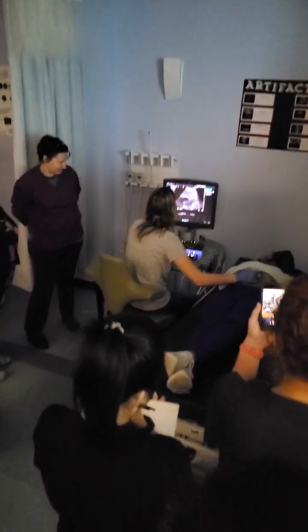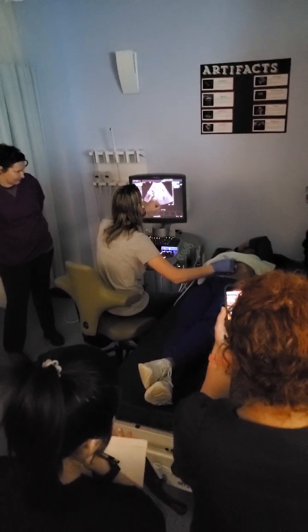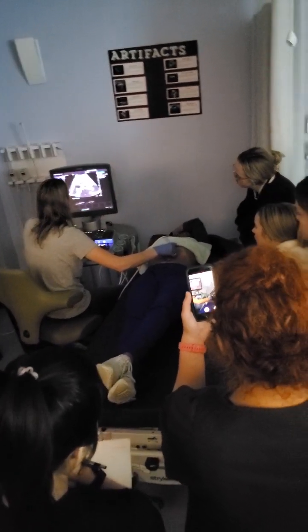So here we are in the left lobe of the liver, so we're all the way up, aiming towards the thorax. We've got the heart coming into that dome. We've got some hepatics, we've got some portals coming through. We're just doing a backup portal line in case.